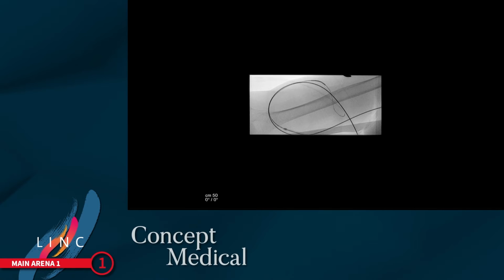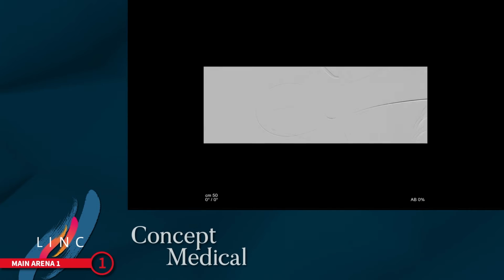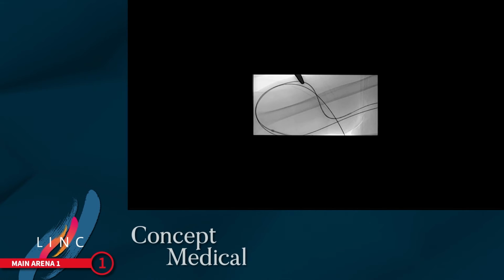You can see the crossing of the arterial graft junction. The wire first goes down into the distal brachial artery. Some resistance here. It's probably a small branch of the brachial artery. And there it is, the main brachial artery. This is how the graphogram looks. You can see the flow of blood into the brachial artery, and there's no flow within the AVG because it's still thrombosed and obstructed by the arterial plug.